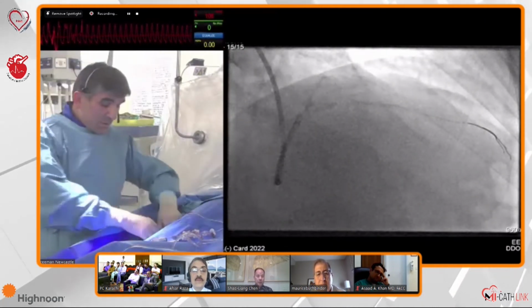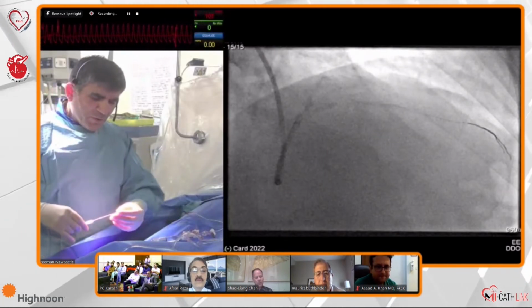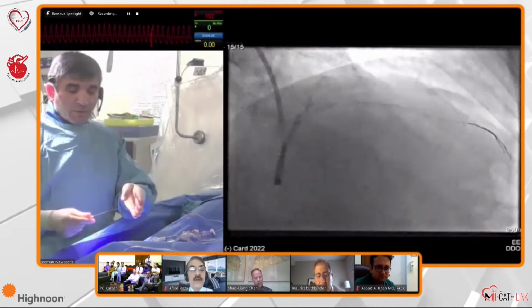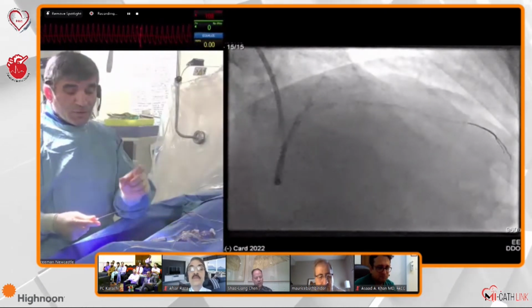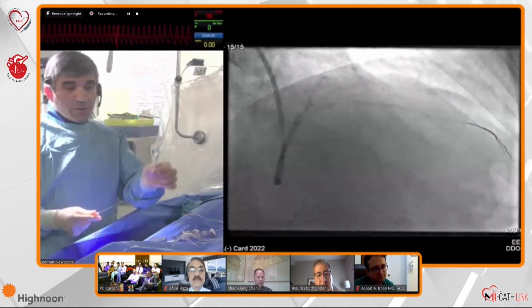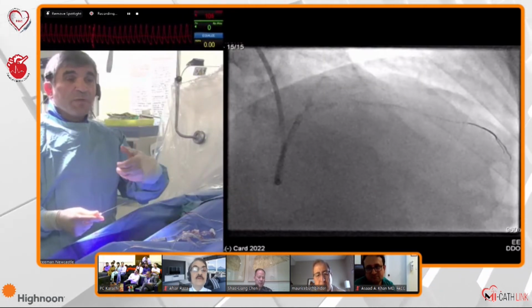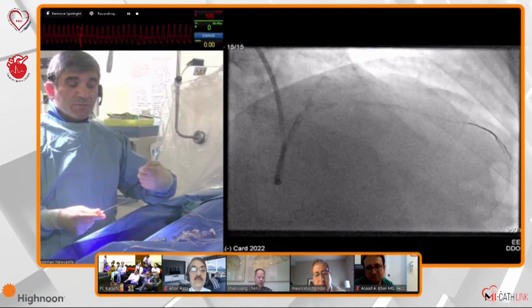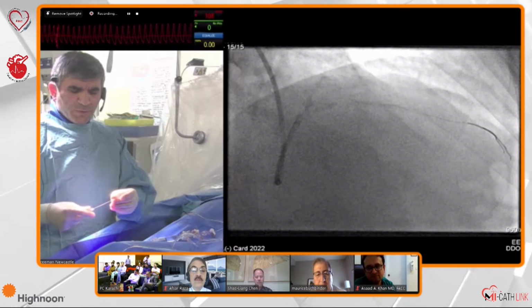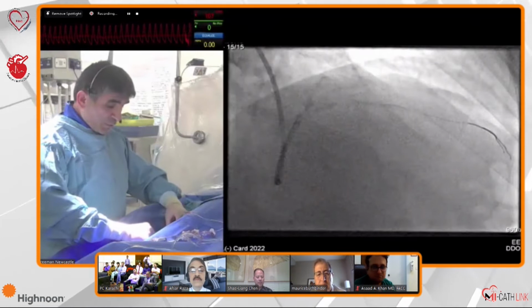Alternatively, and we have published this recently, we use IVUS guidance, particularly for ostial left main. What we usually do is put 2 wires in the LAD or whatever it is, and we put the stent into the left main, then the IVUS next to it, and position the IVUS at the ostial left main, and then bring the stent until we see it on the IVUS. Once we're happy that it's the ostium, we take the IVUS back, making sure the stent stays in place, and then deploy it. We published this, and now we're doing it quite frequently, and we're getting the ostium covered without any problem.